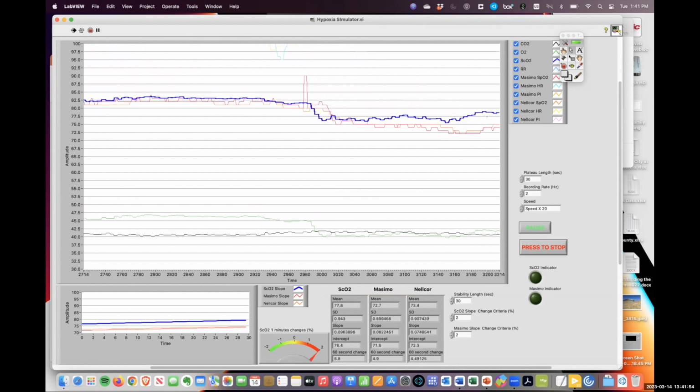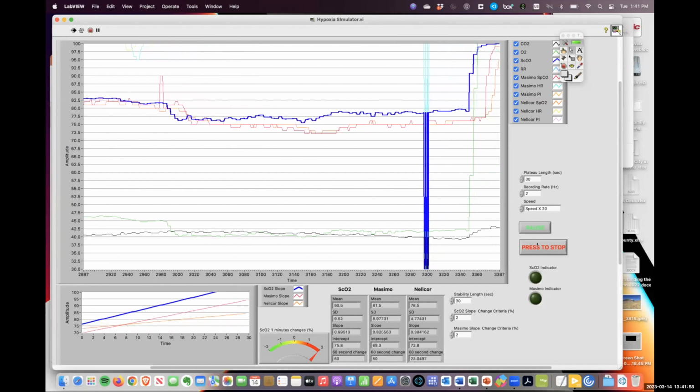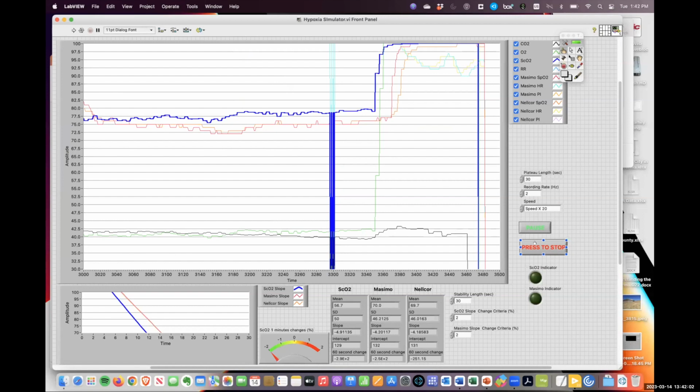And often with the different levels, what we're trying to do is get a few samples in the upper 90s, a few samples in the lower 90s, upper 80s, lower 80s. We do each of those on the different runs, and we can use our oxygen saturation or calculated saturation to be able to do this.